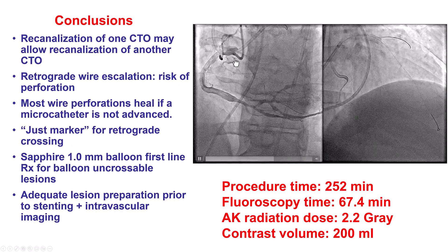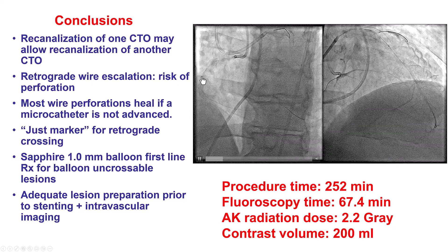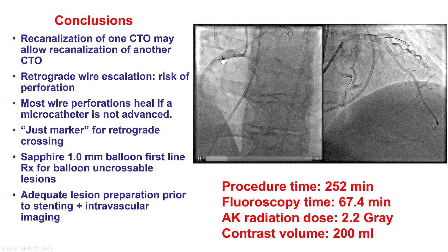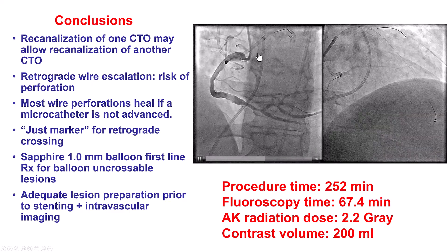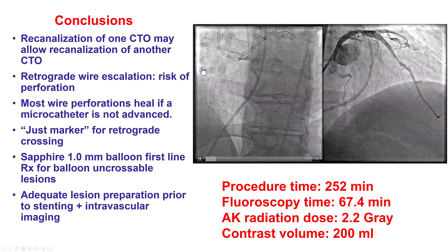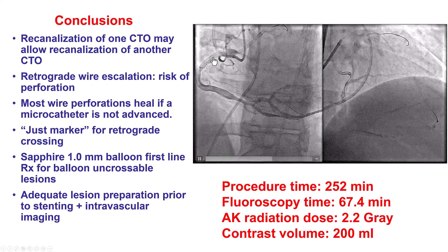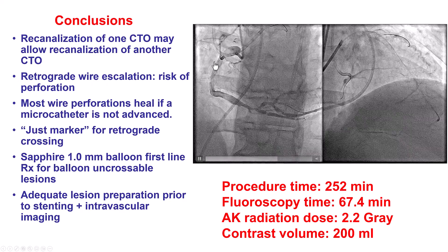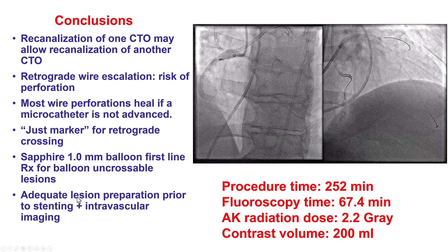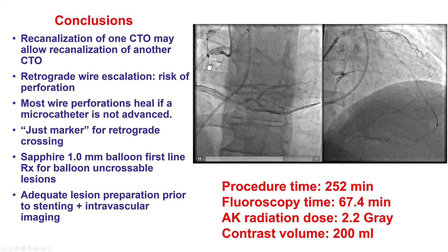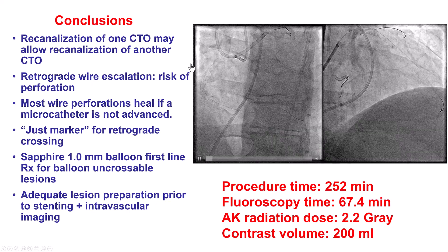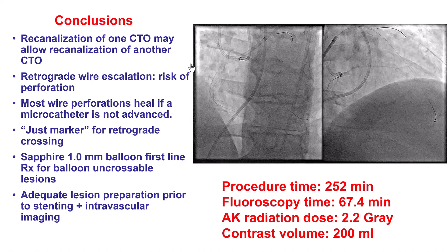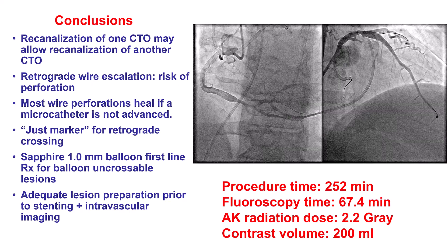The technique we used for crossing was the marker technique: the retrograde wire in the marginal branch served as a marker for where to advance our antegrade guide wire. We had a balloon-uncrossable lesion, and the combination of a Guideliner and a 1.0 mm balloon was successful. Finally, you want to pre-dilate with a balloon sized one-to-one to the target vessel prior to placing a stent to ensure there is no undilatable lesion that might need additional preparation, for example with atherectomy.